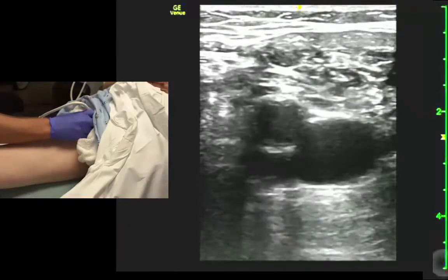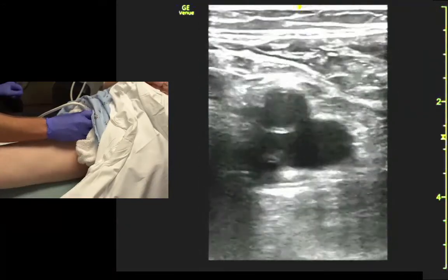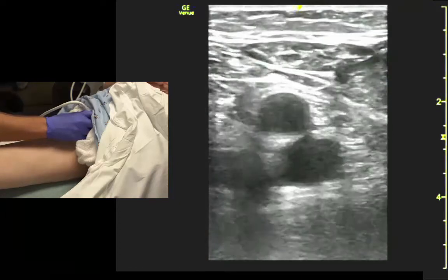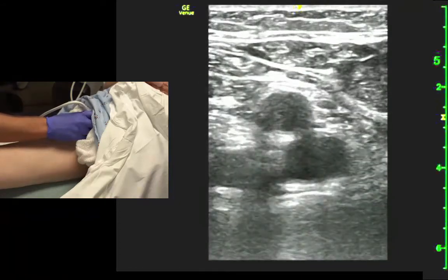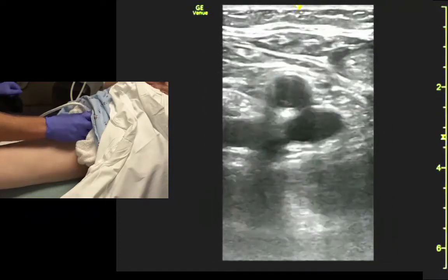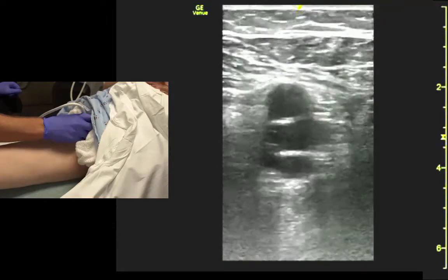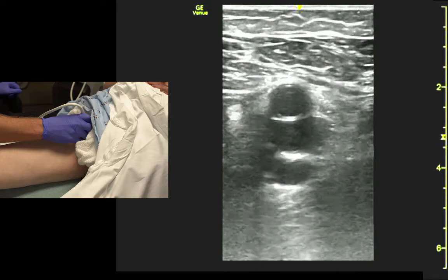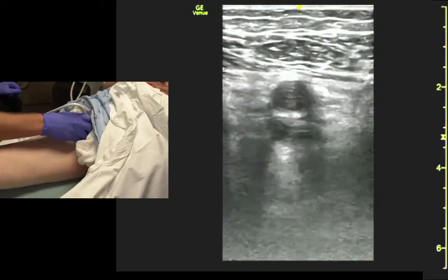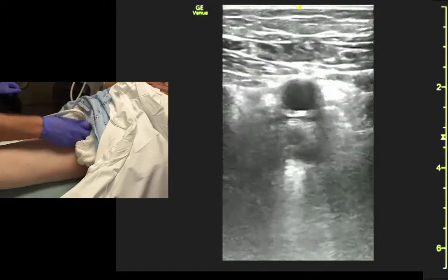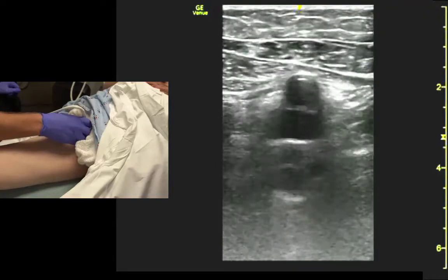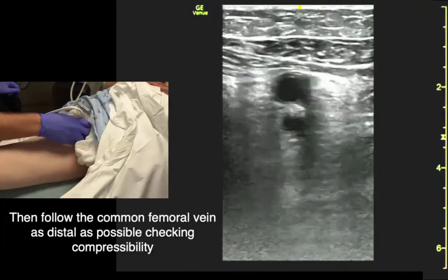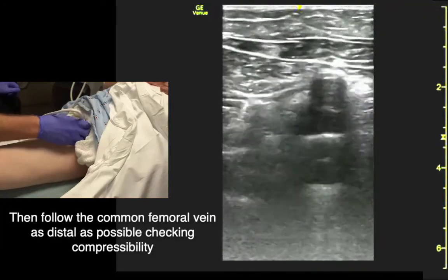We track the vein a little bit more distally. You can see they align themselves vertically. And if we're careful, we can see the vertical split of the deep femoral vein. That's an important landmark when we're looking to rule out DVT — to make sure we see the deep femoral vein as well as the common, and that they both collapse.